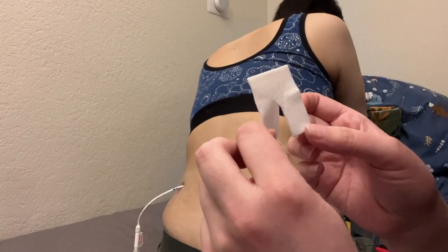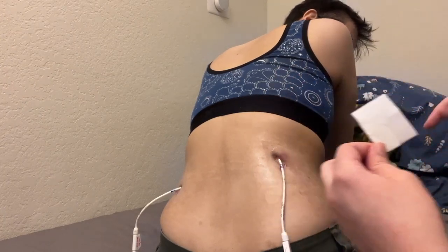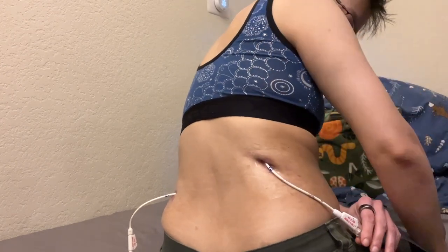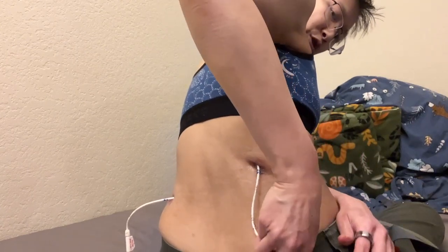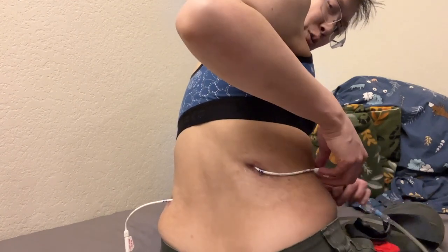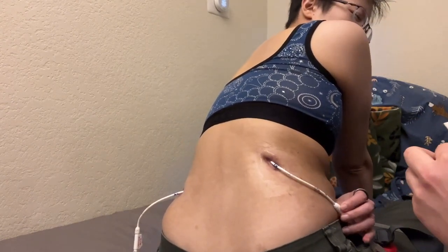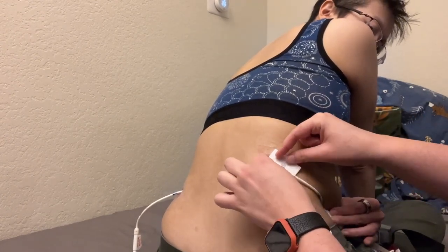I cut it in kind of a Y shape, and that Y shape will go over the tube. This next part — Bren asked can you place the tube where you want it? Because the tube's attached. I want the tube to angle in a particular way. I don't want it straight down because then the drainage bag has to go down my back, and I also don't want it straight across because it pulls and drags. So I usually put it at somewhere approximating a 30 to 45 degree angle, and then I put the dressing over it.